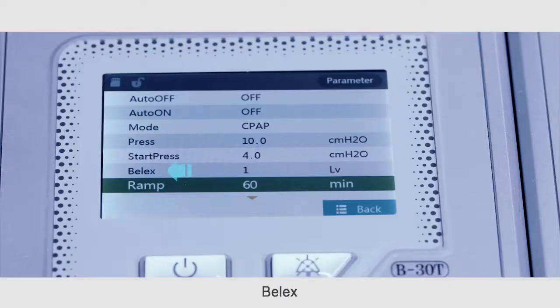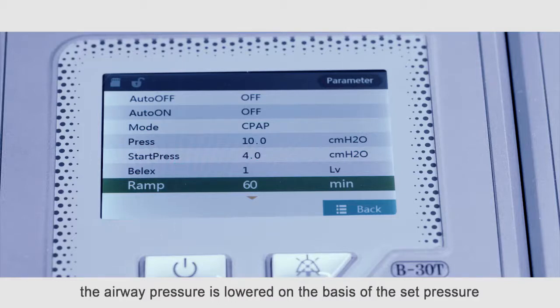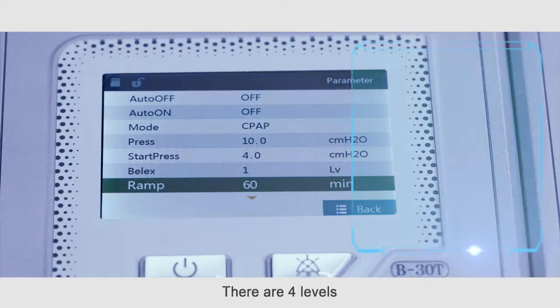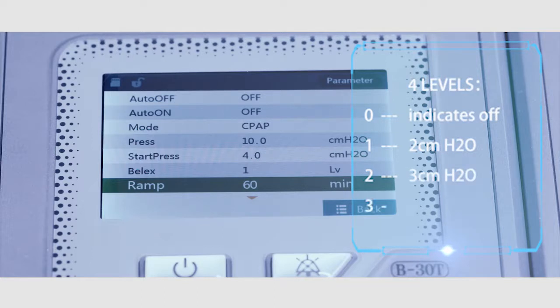Relax: During the expiration period, the airway pressure is lower on the basis of the set pressure. The larger the level, the greater the reduced pressure. There are four levels: zero, one (two centimeters of water pressure), two (three centimeters water pressure), and three (four centimeters water pressure).